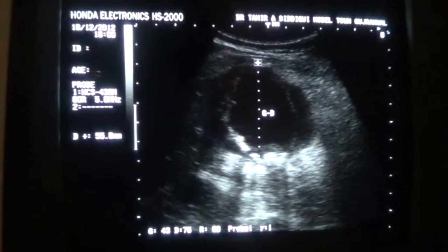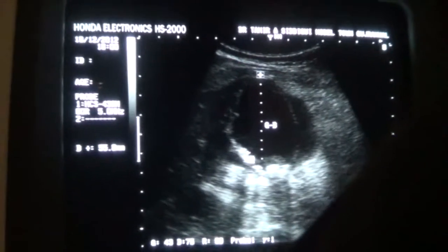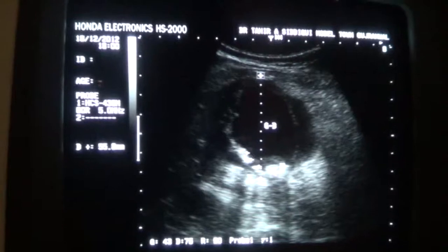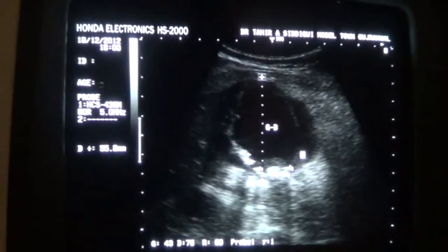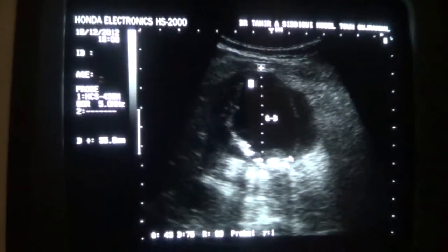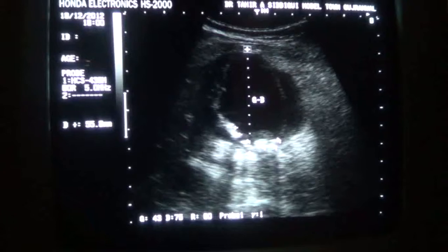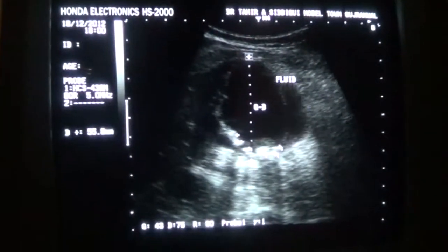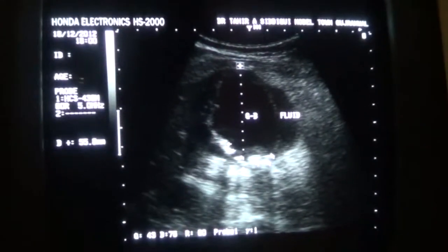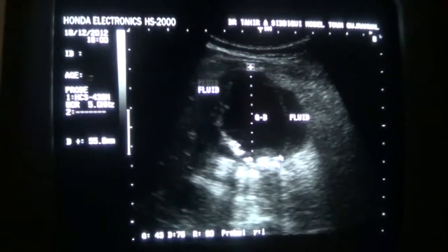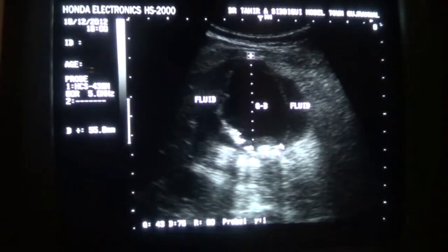These arrows are indicative of calculi within the gallbladder lumen that are mobile. This is the posterior wall of the gallbladder, this is the anterior wall of the gallbladder, and this is the fluid surrounding the posterior wall. Here we also see fluid surrounding the anterior wall of the gallbladder in transverse section.